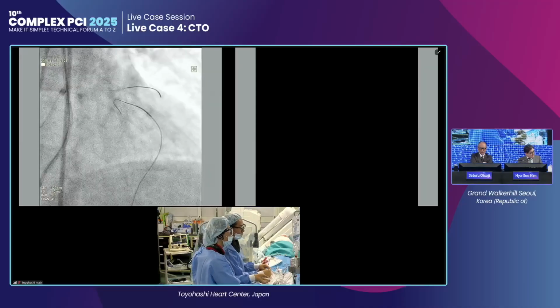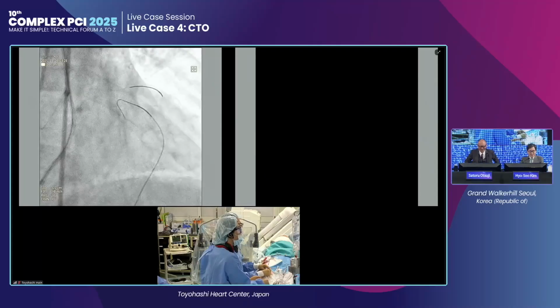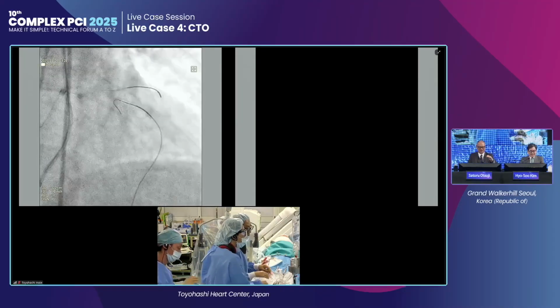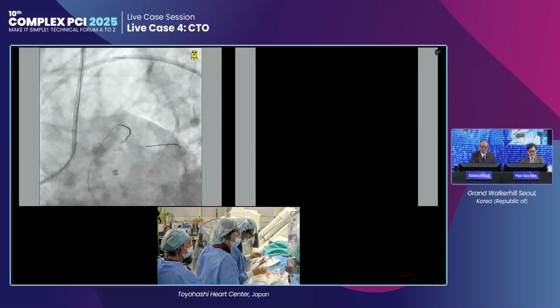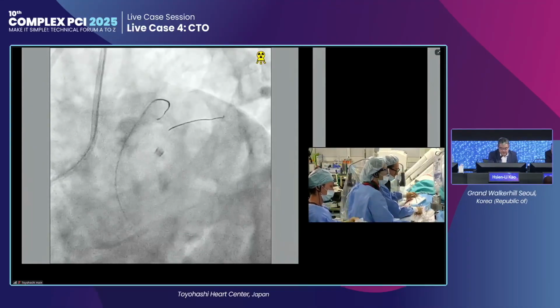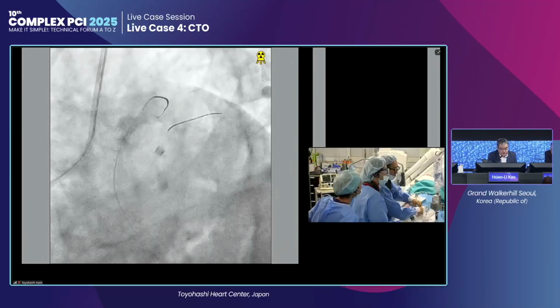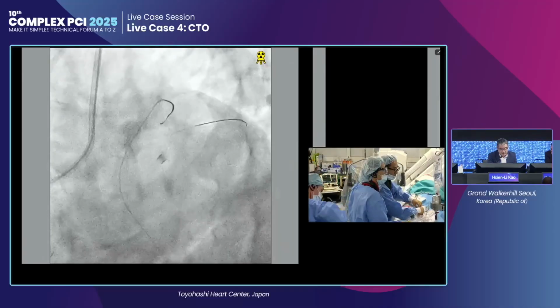Is there a comment from the panels, Dr. Kao and Dr. Otsuji? Well, you are very persistent on the septals. Congratulations. But I think I can see ipsilateral epicardial channels from the diagonal to the ipsilateral diagonal. Thank you so much. Also some epicardial channels coming from the conus branch or the RV branch of the RCA. So sometimes these other alternatives can also be considered.